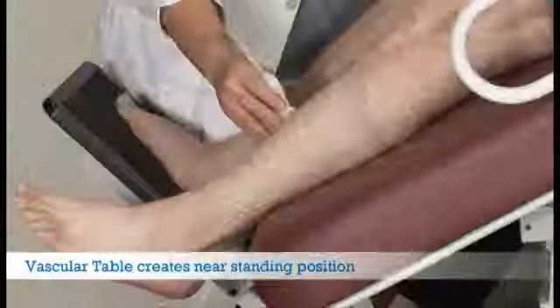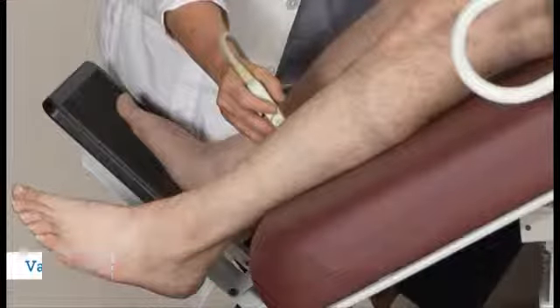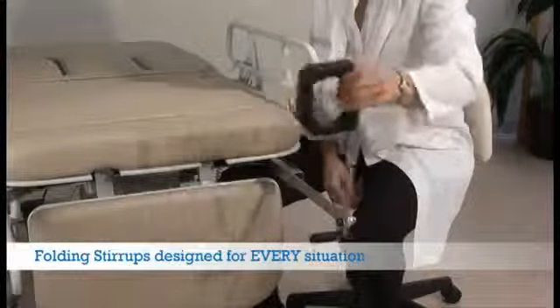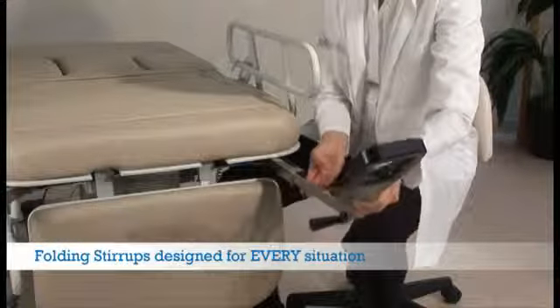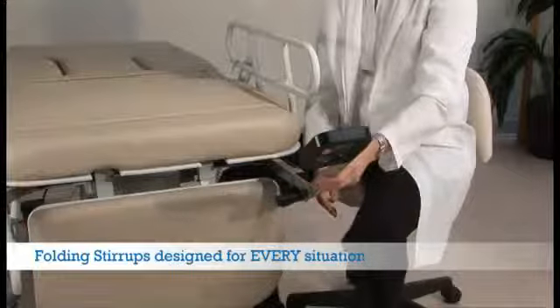The unique foot supports can be easily moved out of the way and securely support any client. Optional stirrups come standard on the multi-specialty bed and feature a very wide range of angles and lengths to accommodate any patient or procedure.